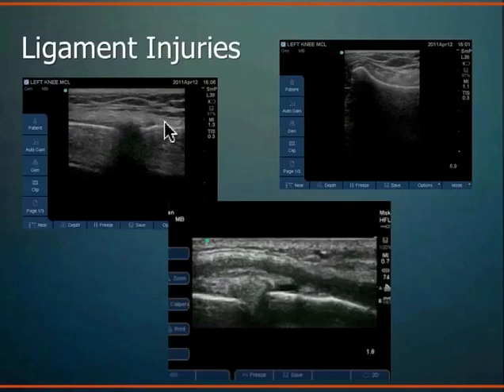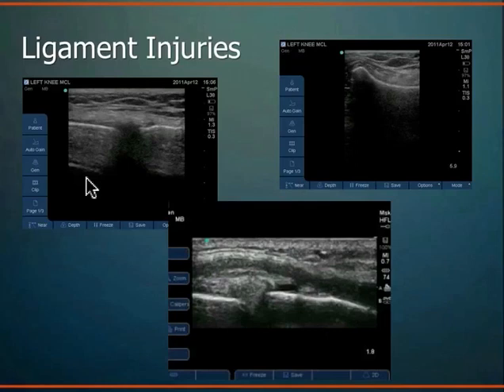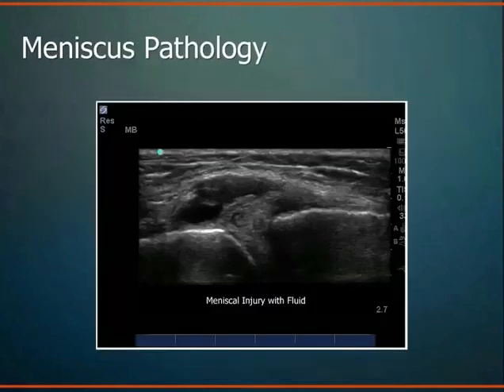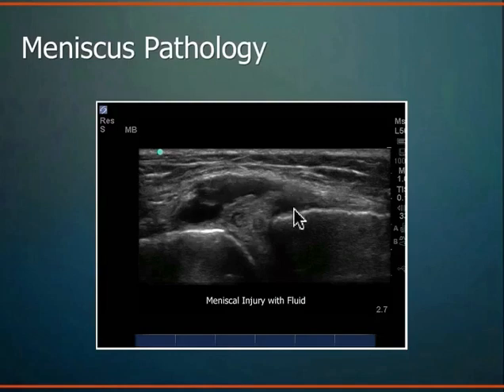For ligamentous injuries: this depicts a normal MCL with the femur, tibia, joint space, and the dense fibrillar MCL structure — similar to tendons but a little more hyperechoic and dense. A distal MCL tear shows disruption of the tissue distally with no ligamentous tissue remaining — it has retracted proximally. For meniscus pathology: you can see the joint space, femur, tibia, joint capsule distension, joint swelling, and displaced meniscus with meniscal cysts. There are deeper zones of the meniscus that ultrasound cannot image, requiring MRI for those areas.